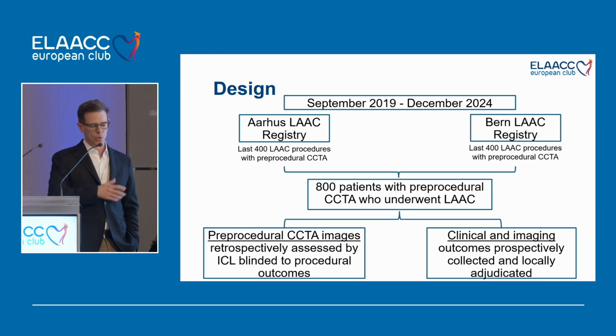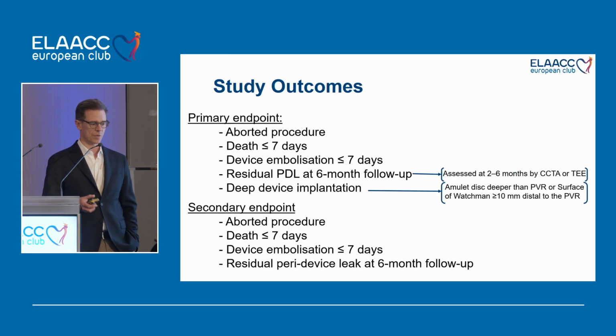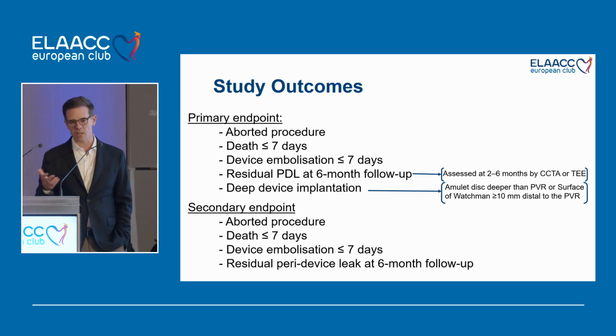As said, from both sides we included 400 patients, makes a total of 800 patient cohort that had a serial CT, and we assessed the pre-procedural CTAs and the follow-up CTAs, and assessed the clinical and imaging outcomes in a prospective fashion.